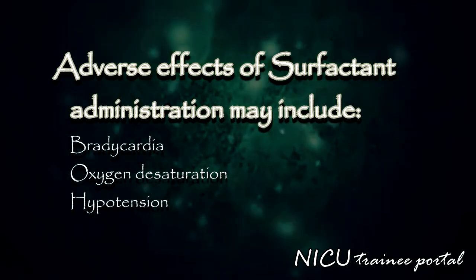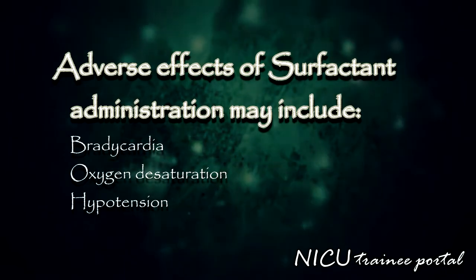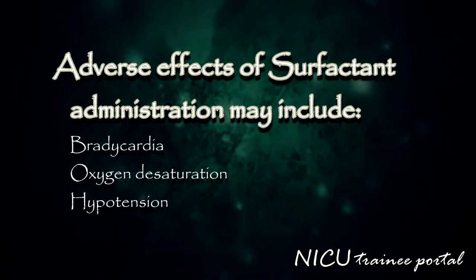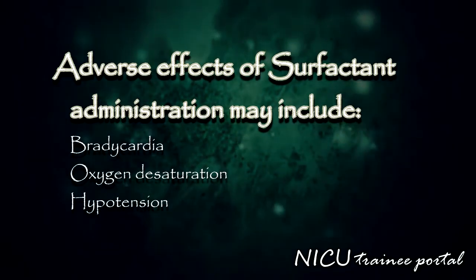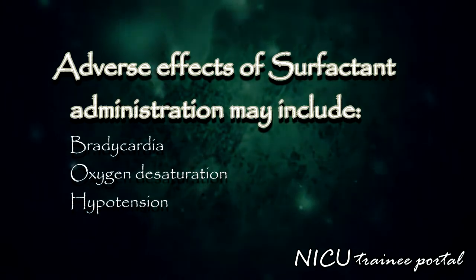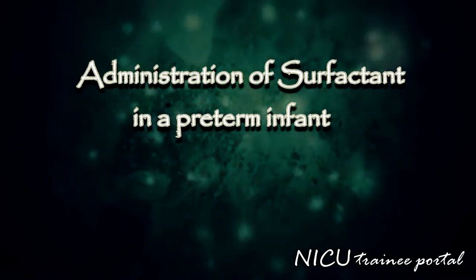Transient adverse effects of surfactant administration may include bradycardia, oxygen desaturation, and hypotension. Therefore, it should only be administered by those who are trained and experienced in the care, resuscitation, and stabilization of neonates. There are several different ways to deliver surfactant replacement therapy to a neonate.